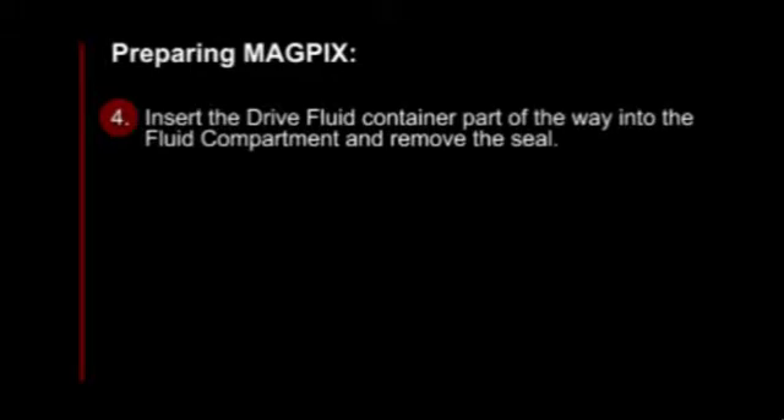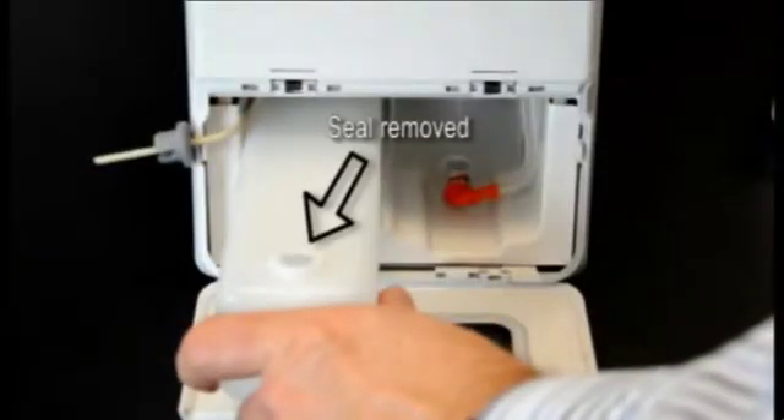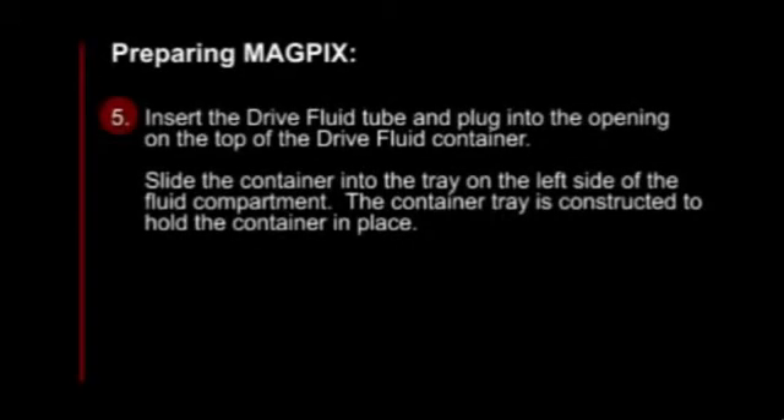Your fourth step, insert the dry fluid container part of the way into the fluid compartment and remove the seal. Now, we're going to insert the dry fluid tube and plug it into the opening on top of the dry fluid container.